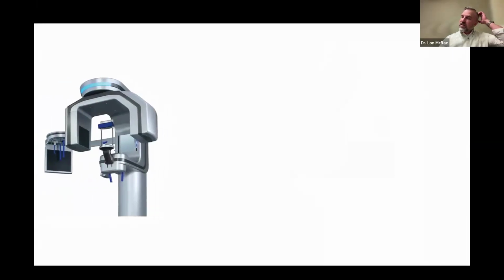So the first thing we do is we take a CBCT. We have to be able to have a CBCT, and we have to send that to our designer. This is Marius von Totter, and he's in Belize, and we have another designer in Utah. So I send it to them. It has to be a DICOM file. So you definitely want what we call an open system. He gets it all the time from places that don't have an open system. It doesn't work unless it can be a DICOM file in an open system.